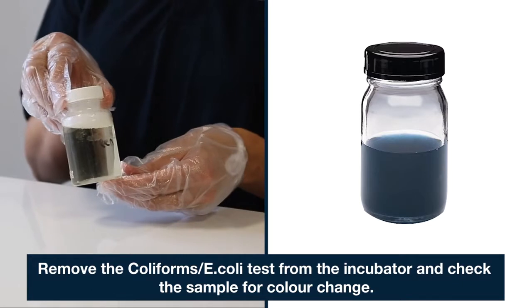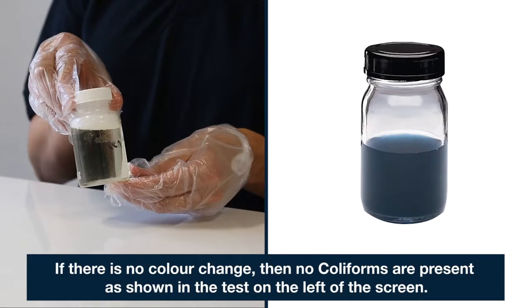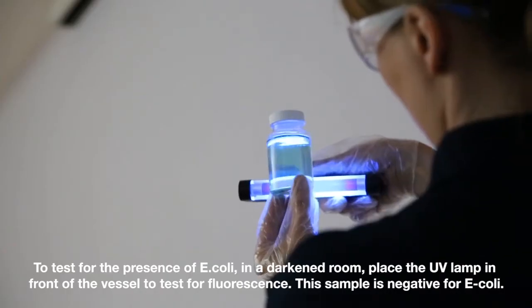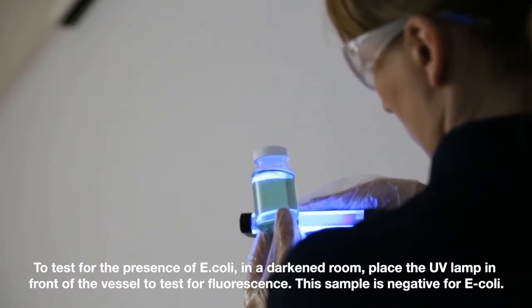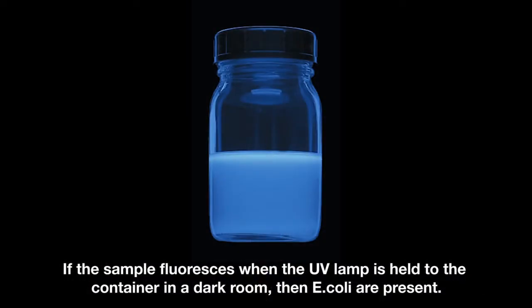24 hours later. Remove the coliforms E. coli test from the incubator and check the sample for colour change. If there is no colour change, then no coliforms are present, as shown in the test on the left of the screen. If the colour of the sample changes to blue-green, as shown in the test on the right of the screen, then coliforms are present. To test for the presence of E. coli, in a darkened room place the UV lamp in front of the vessel to test for fluorescence. This sample is negative for E. coli. If the sample fluoresces when the UV lamp is held to the container in a dark room, then E. coli are present.